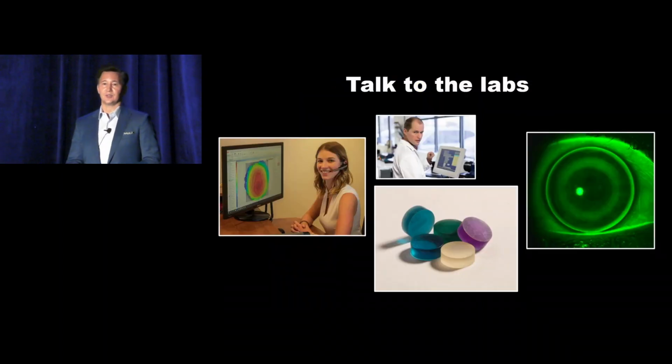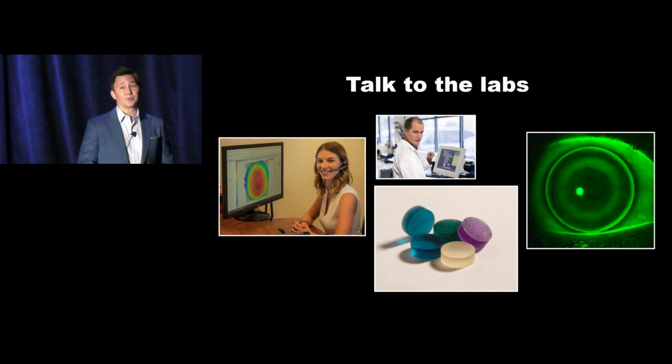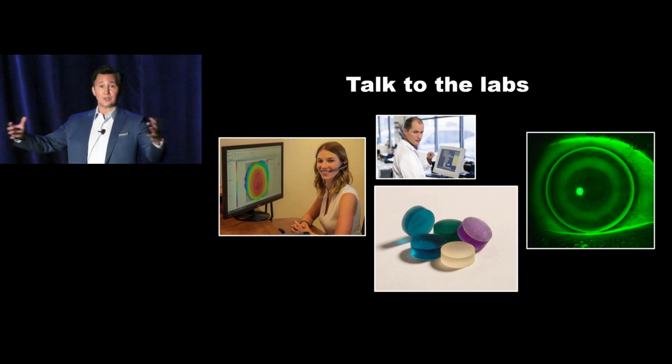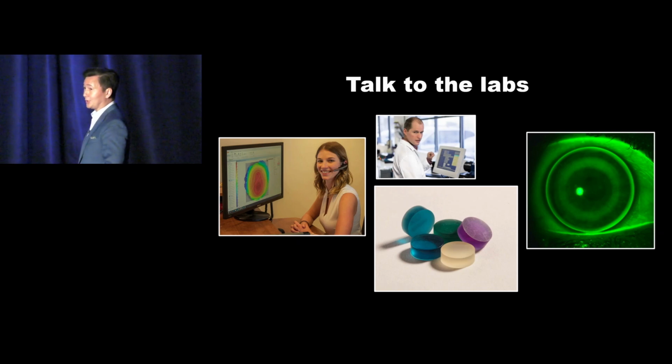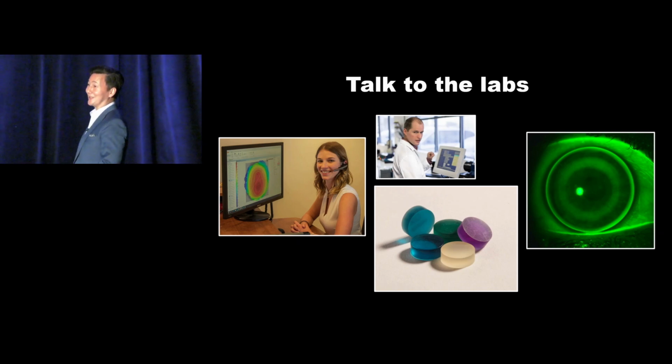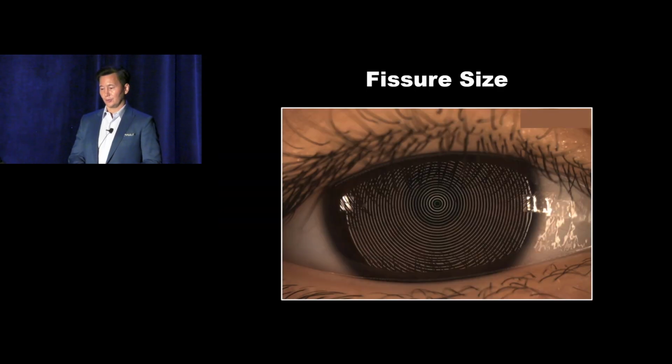I might suggest to you, talk to the labs in the exhibit hall. If you've chosen a design, they may favor a specific instrument that seems to be the best tool for working with their system. So that is a way to go, and certainly talk to your colleagues here. There's so many experts that have tons of experience, many of which have had every topographer. So that's a great way to get understanding of which instrument you should use.